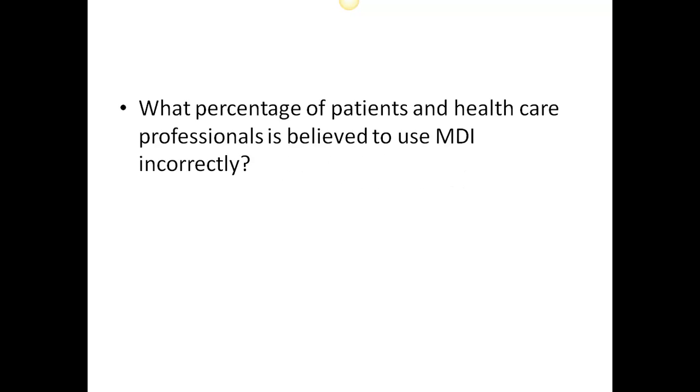The first question we'll discuss: what percentage of patients and healthcare professionals is believed to use an MDI incorrectly? The answer here is up to 2/3 of people use the device incorrectly. This leaves a lot of room for us to improve patients' technique by continual coaching.